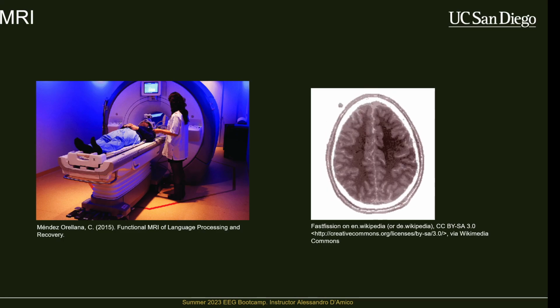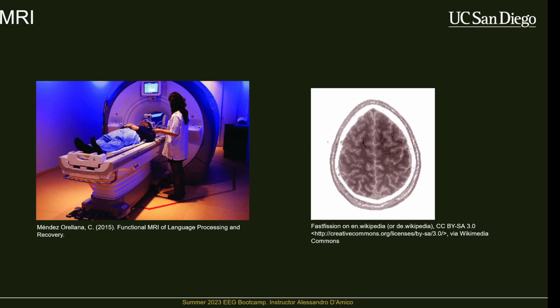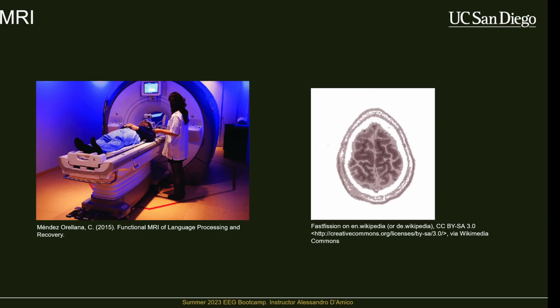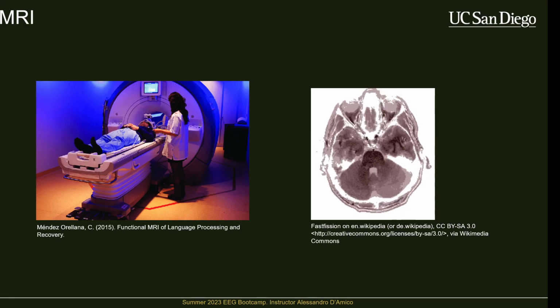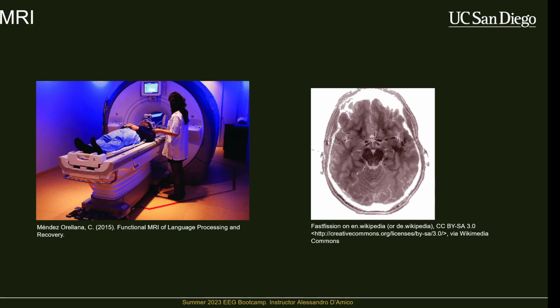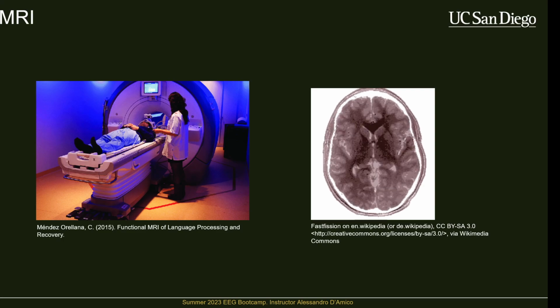transcranial magnetic stimulation. So with TMS or rTMS, you want to target very specific regions of the brain and zap them with a magnet. And everybody's brain is pretty different. So we have different sulci and gyri, the folds of the brain. And depending on who you are, those folds are going to be different. So if I'm trying to target a region here for somebody, it might be really at the surface, right on the cortex, but for another person, that same region is buried inside of a fold deeper in the brain. And if you're trying to target specific brain areas, you sort of need to know how somebody's brain folds. So regular MRIs are useful for that.